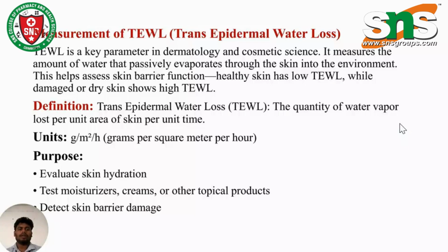My topic is the measurement of TEWL, transepidermal water loss. It is a key parameter in dermatology and cosmetic sciences. Healthy skin shows low transepidermal water loss, while damaged or dry skin shows high transepidermal water loss.